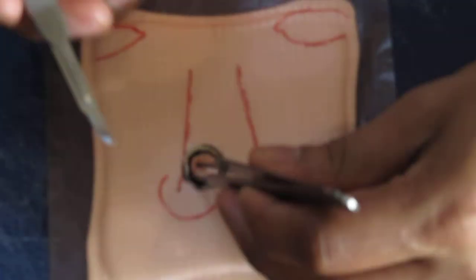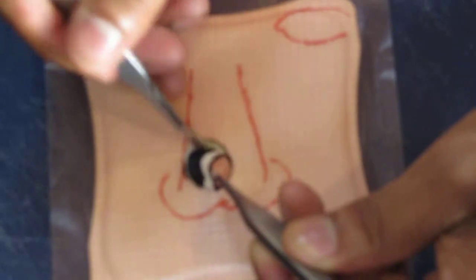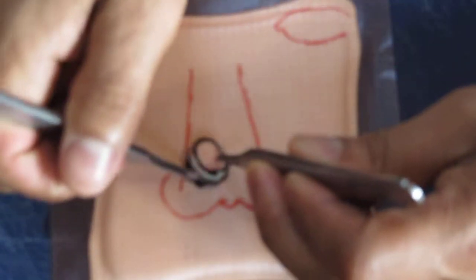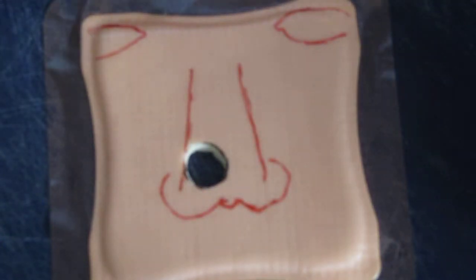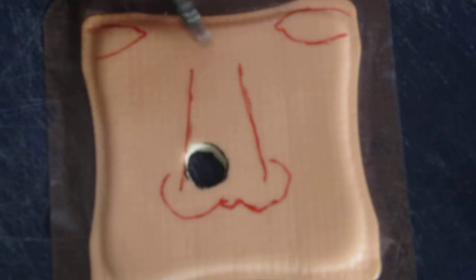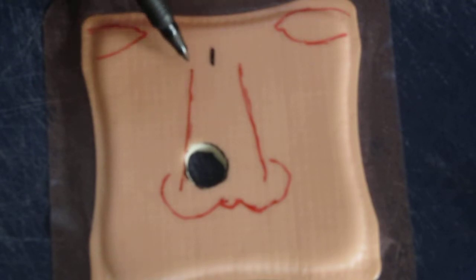Okay, now the bilobe flap is two transposition flaps basically that fit into each other, and it's an excellent flap on the nose and sometimes on the cheek, when the area of tissue laxity is quite far away from the defect. So on this person, the area of tissue laxity is probably the dorsum of the nose, but just to make the scar fit away from the center of the nose, which is the center of the face, which is here, we're going to take it adjacent. We're going to move it over to the side, just to the medial canthus.